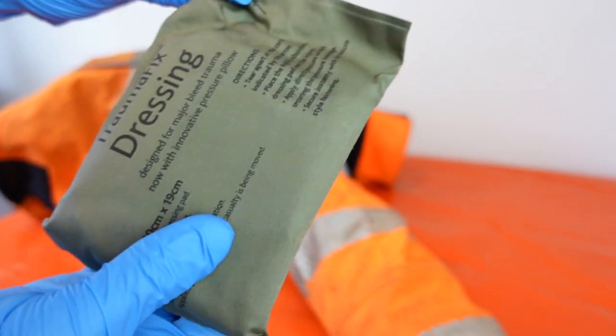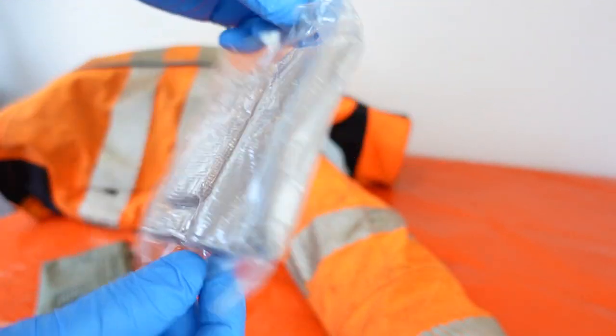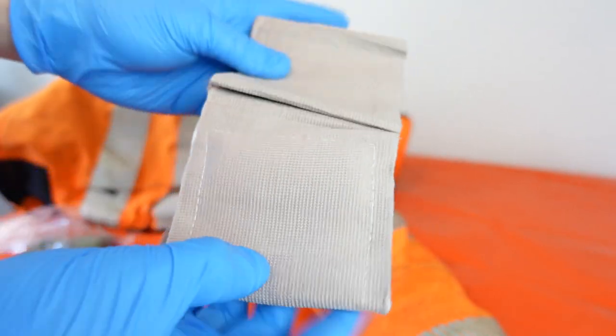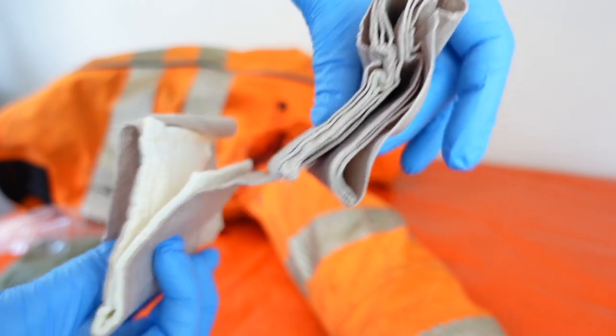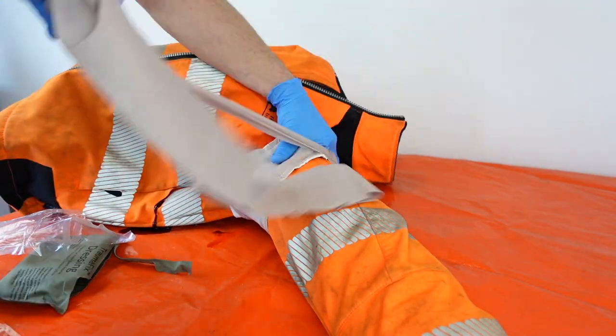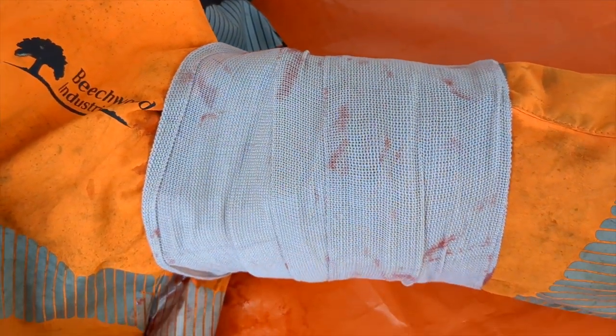A bandage can then be applied over the top. The bandage is a trauma fix dressing used by NATO forces — a sealed and robust waterproof pouch with a pillow-style absorbent pad and an elastic bandage. Native have opted for the medium 10 by 19cm bandage, which is more than adequate and keeps the kit nice and compact.